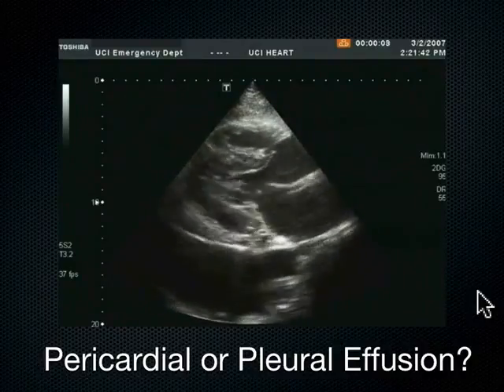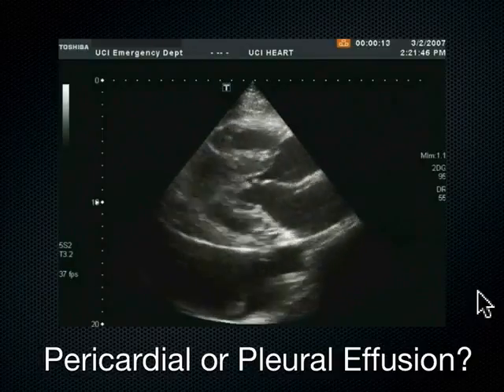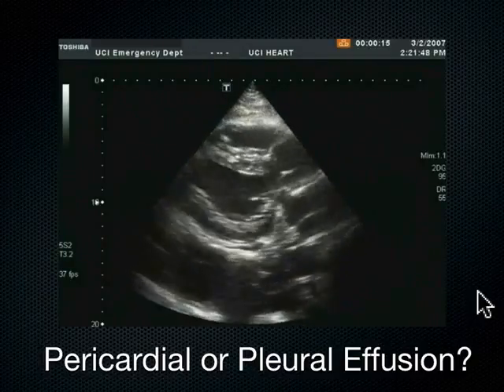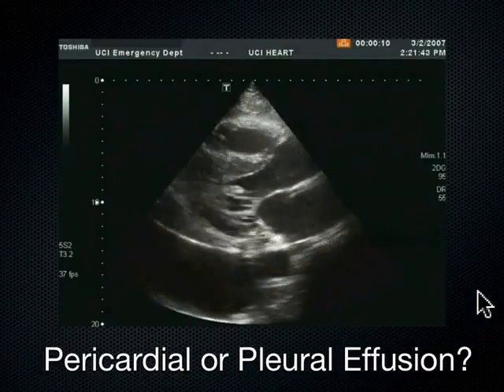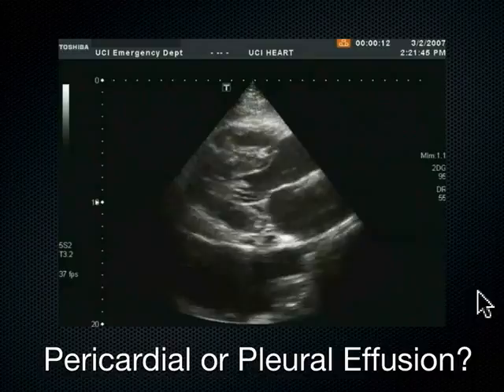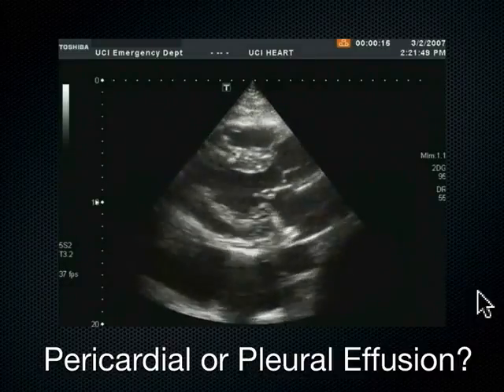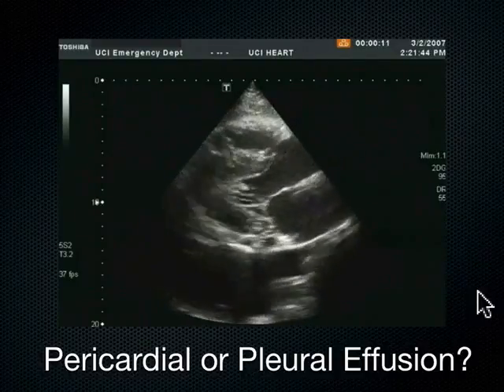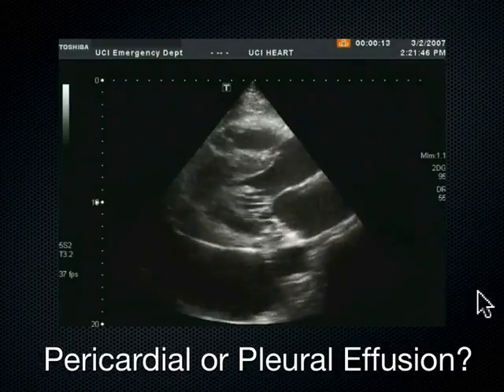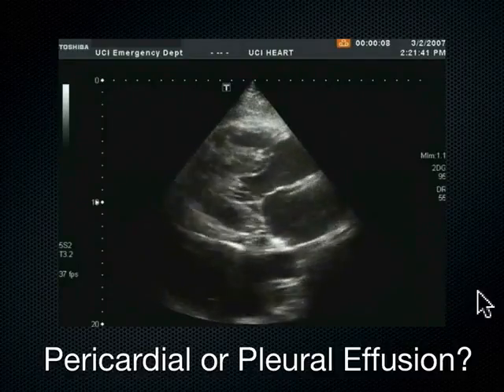If it wasn't for that descending aorta, how do I normally diagnose a pleural effusion on the left? Simple. I go into my FAST exam window, looking at the spleen and the diaphragm. I look superior to the diaphragm, and if I don't see the mirror image artifact of the spleen up in the chest, if I see all this black stuff on top of the diaphragm, looking coronally, laterally with the P21 probe, then I know, with the same probe I'm using for this, that this confirms to me that this is pleural. I always do that.